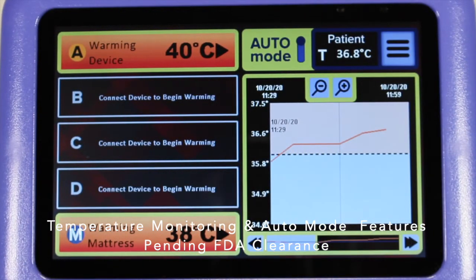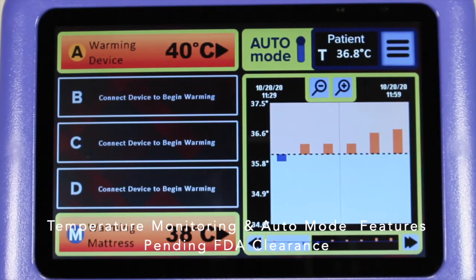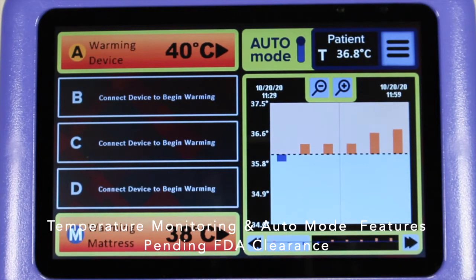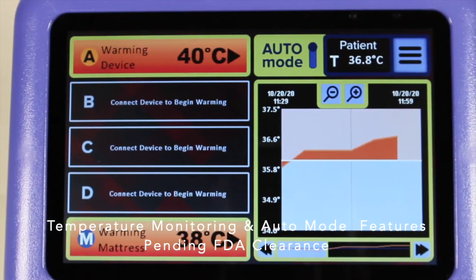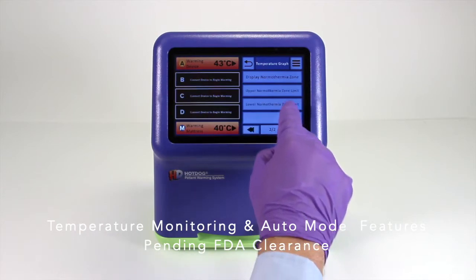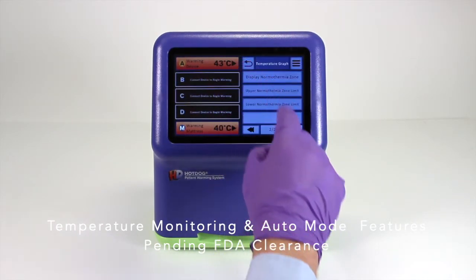The graph style can be selected in settings under temperature graph. This same temperature data can be outputted to the EMR using a standard table. Prior to using auto mode, the desired normothermic range is preselected by the clinician. The top and bottom temperature in the normothermia zone must be at least one degree Celsius apart.